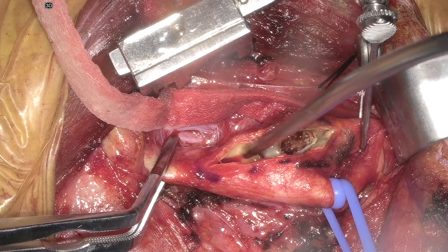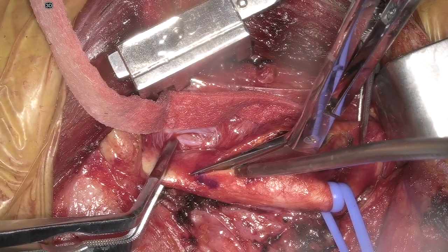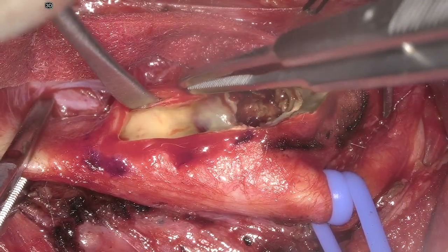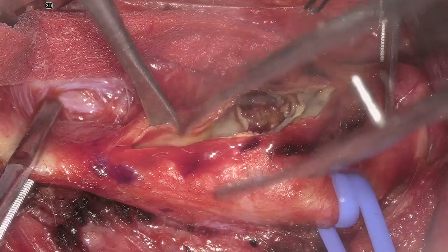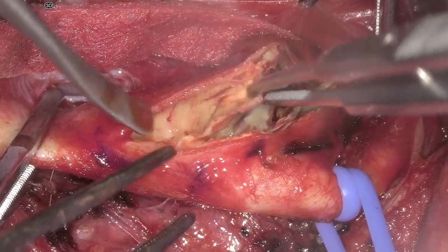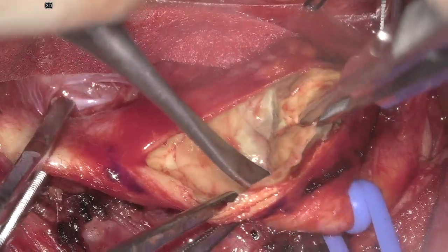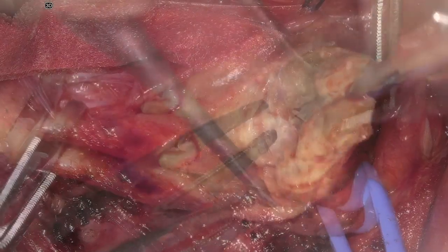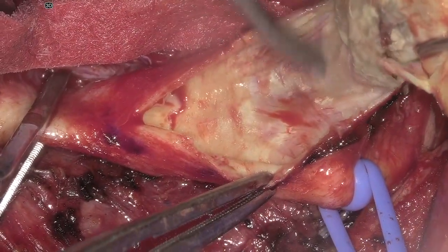We extended the arteriotomy a little bit more proximally, then used fine forceps and an olivecroña dissector to develop the plane between the plaque and the arterial wall. We elevated the plaque out of the external first and then into the internal, getting the plaque out nearly in one piece with a beautiful vessel wall.